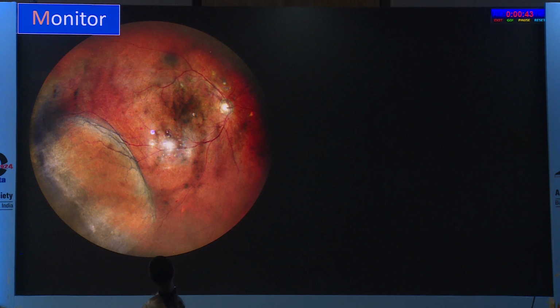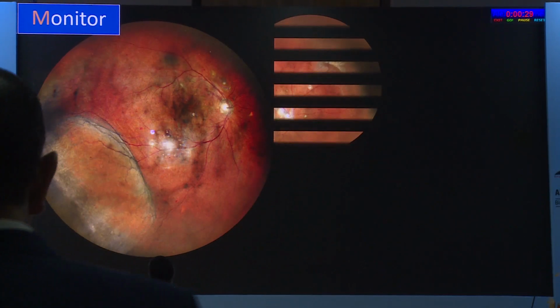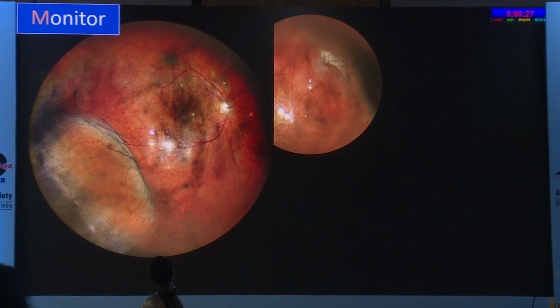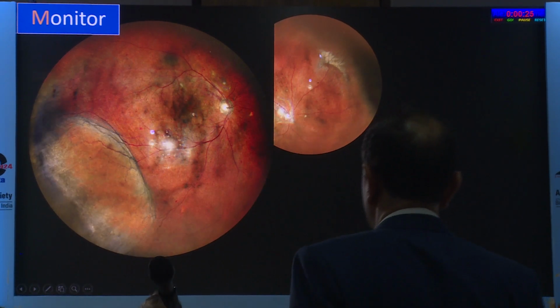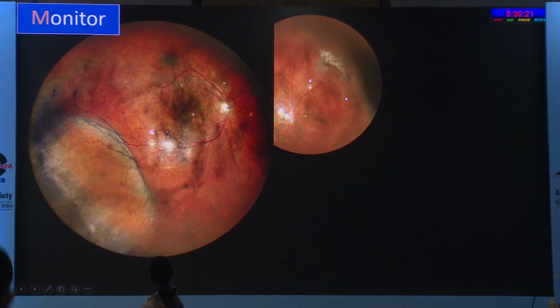2 months later, he presents with sudden decrease in vision. You can see a massive choroidal detachment. You can see the ora serrata so clearly in this. Such a beautiful image though, not so good for the patient. Supranasally, I could see areas of subretinal fibrin with exudation. So the patient had acute renal failure with fluid overload and exudation throughout the body.